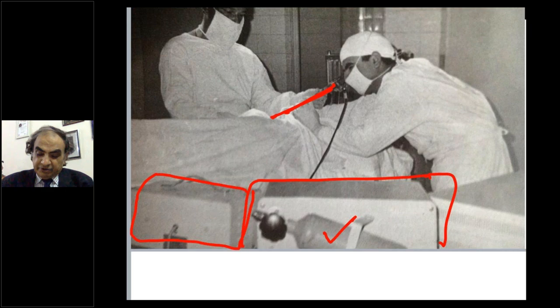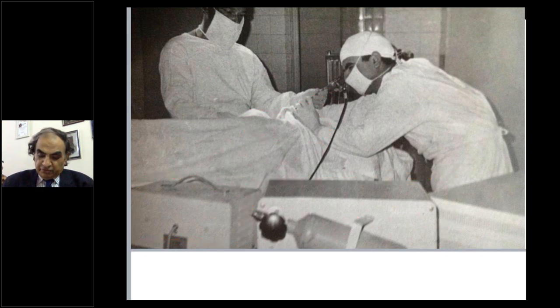I'm trying to do a complete diagnostic laparoscopy. Then I'll go to the other side and see it on this side. And the other port is already in place. So it is important to know that these are old times and we have moved on from there.